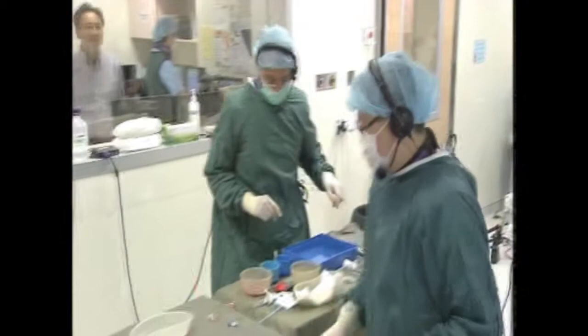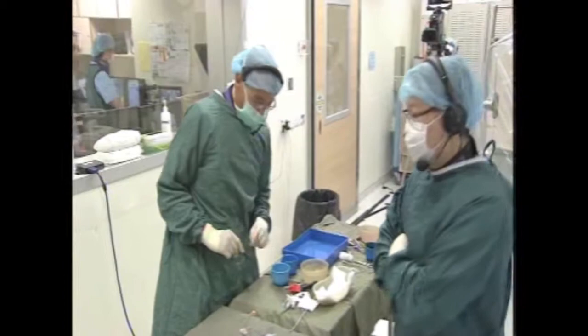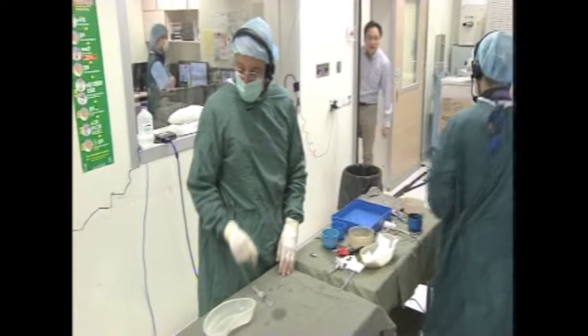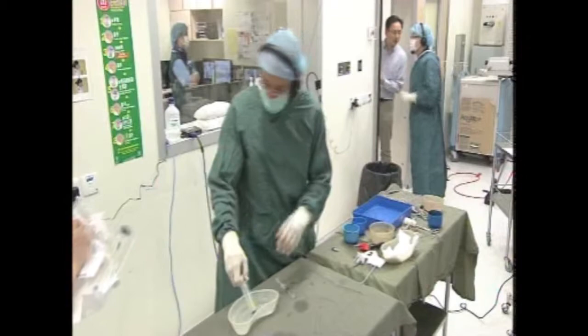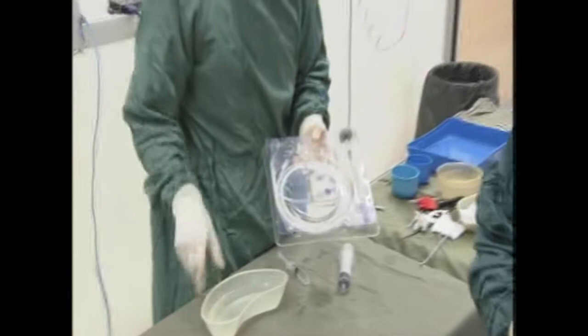The delivery sheath for the 30mm device is a 13 French sheath. I'm advancing the device slowly through the sheath while giving the patient continuous saline flushing to avoid introducing air into the system. It's always good to start fluoro on the right side — if you see air, you can de-air before crossing to the left side.